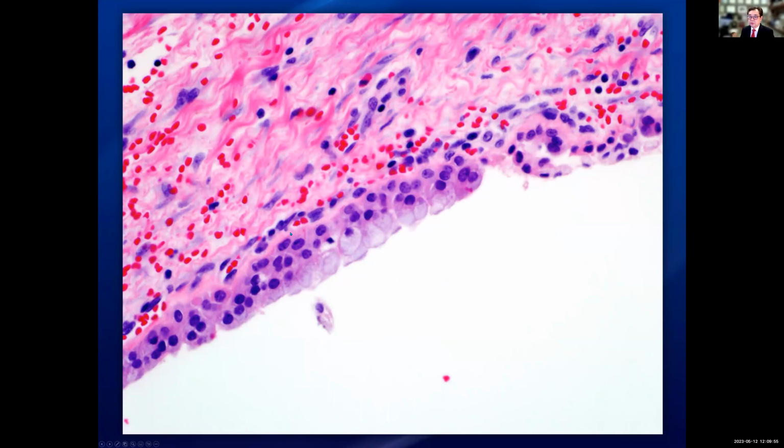And mucocyte again. And because of the clinical presentation, we felt this was probably an invasive growth pattern. We thought this was probably a low-grade mucoepidermal carcinoma, so we did a FISH for MAML2. This is not that new.